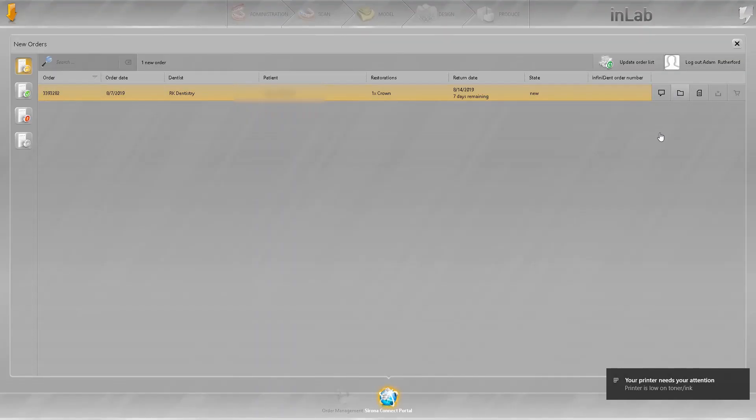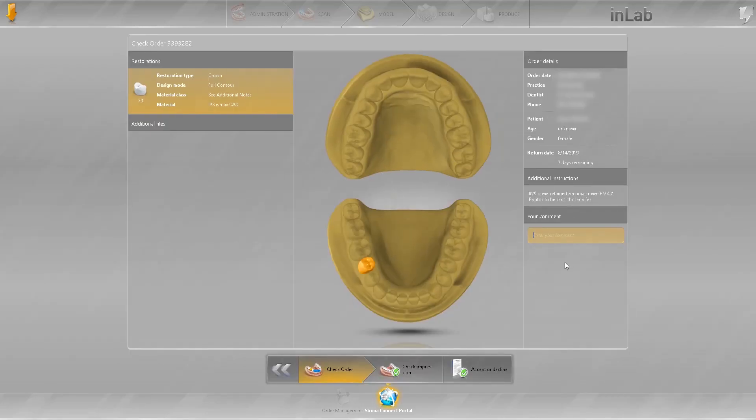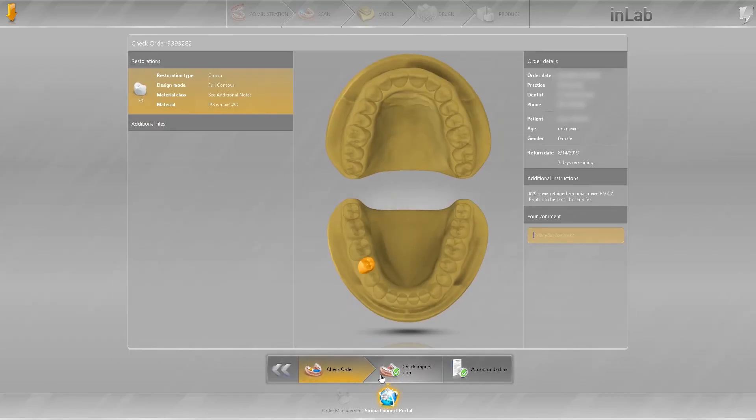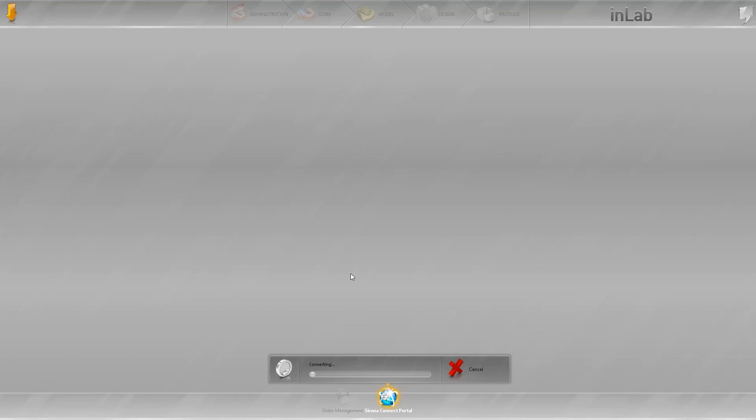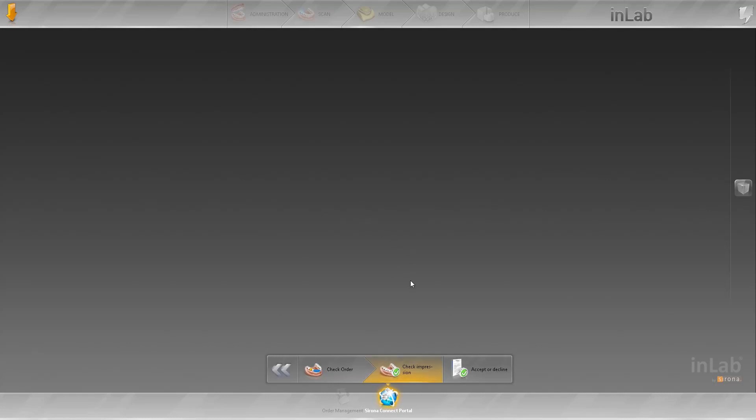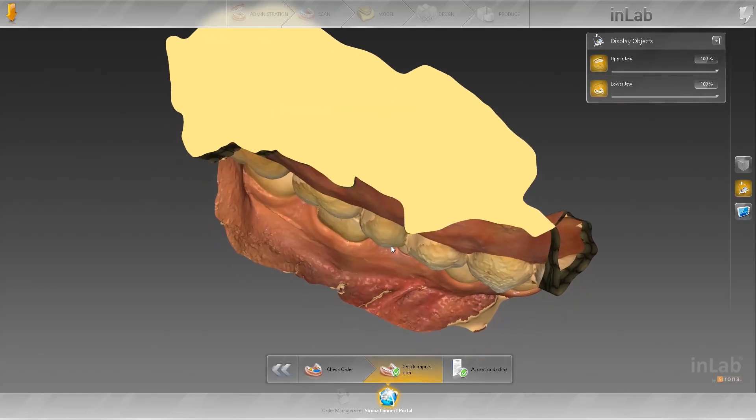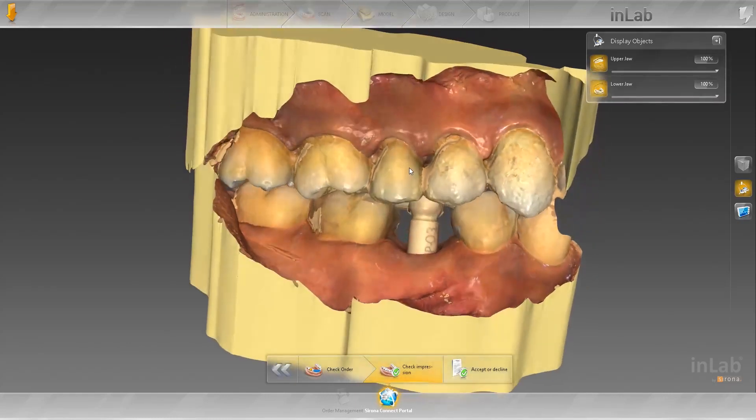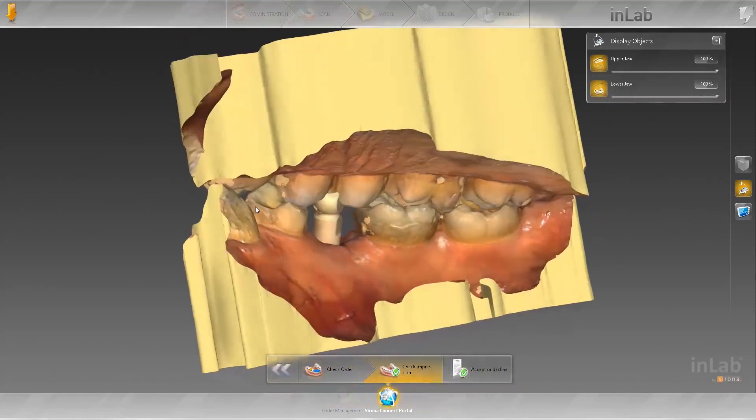I'll go ahead and check your impression. You can go ahead and design your cases in this software. I don't particularly like it, mostly to the fact that I'm not used to it and I enjoy using ExoCAD so I import everything in there.